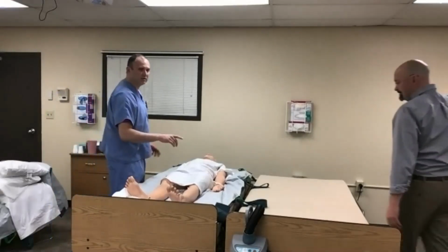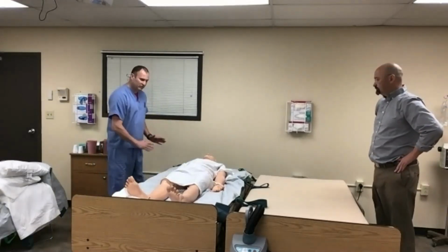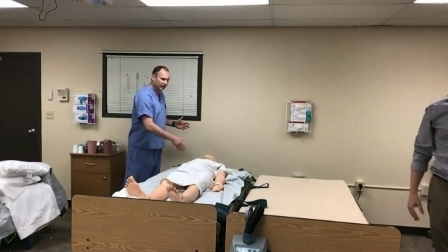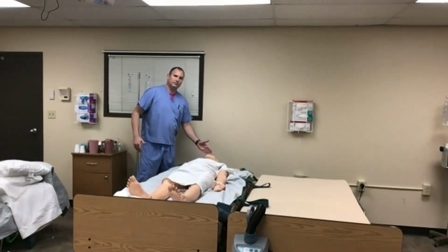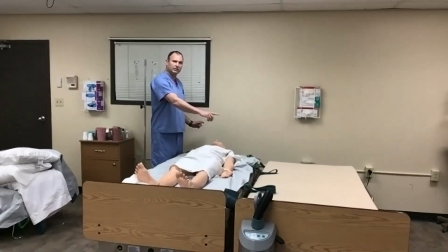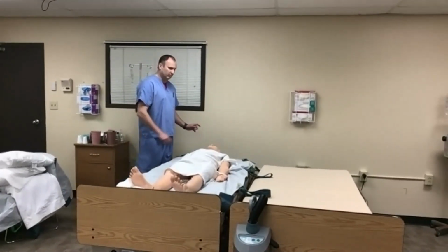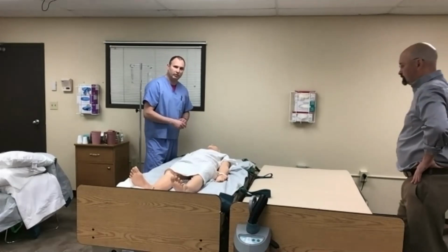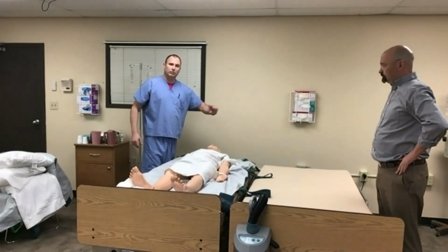Before you continue, I just want to touch a little bit more on line preparation in the ICU. At the head of the bed, off to one side, you're obviously going to have your ventilator here. We all know ventilator tubing is only so long. So when we go through this technique, the headboard would need to be off so that we can slide the vent along with the patient as we laterally transfer the patient for proning, to make sure that the line goes along. Make sure you consult with your respiratory therapist. Probably have them there to help manage that line so there's enough slack when you go to prone the patient.